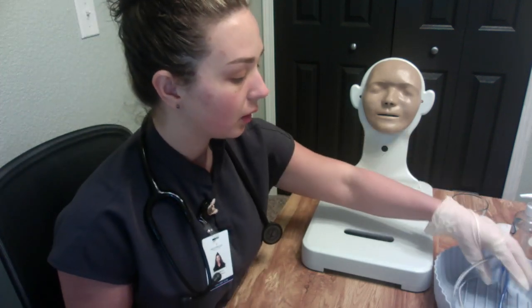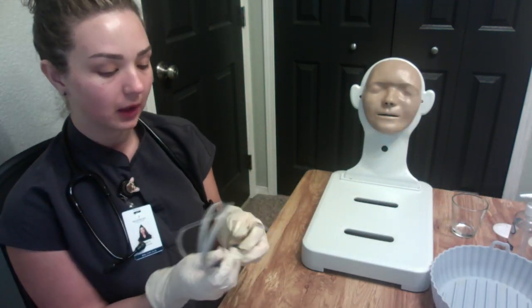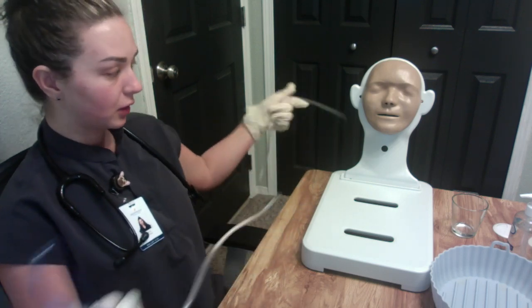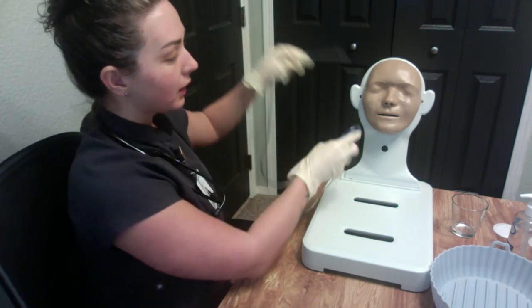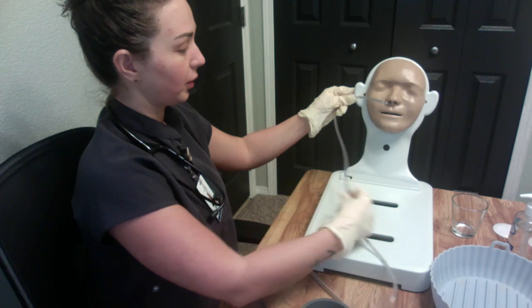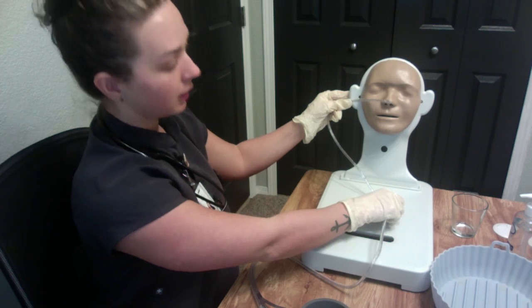Alright, so before we insert the NG tube, we want to make sure that we measure it appropriately. When we are measuring placement, we are going to start at the tip of the nose to the earlobe and down to the xiphoid process. Okay, so about 50.